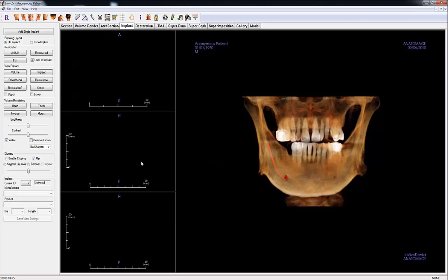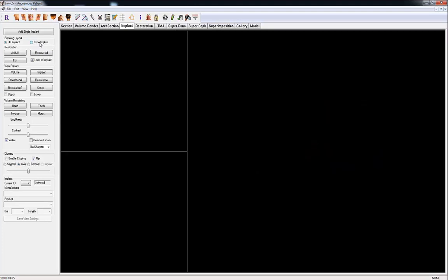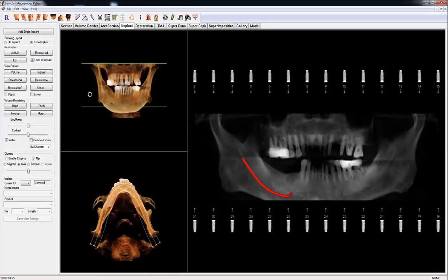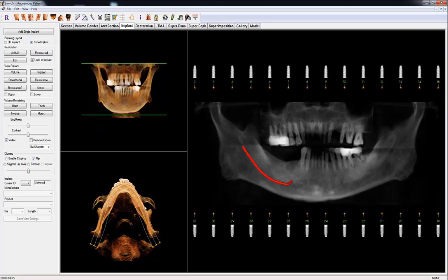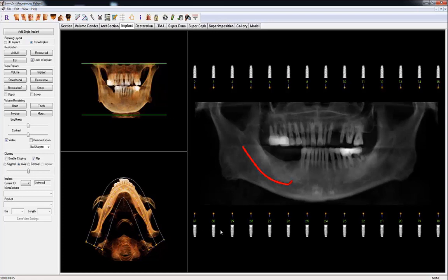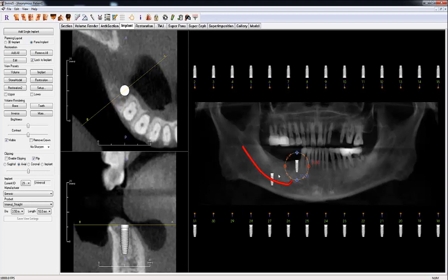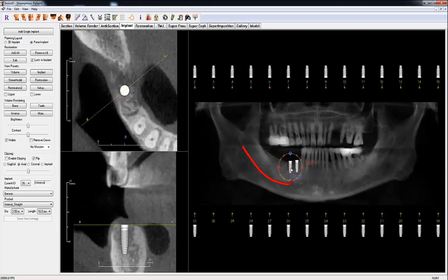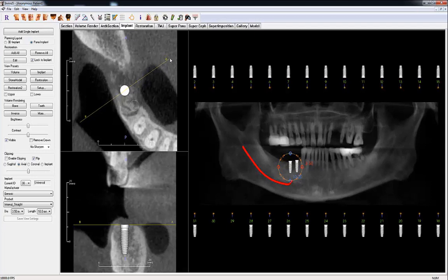The second method to insert implants is to place multiple implants in the panel implant view. To adjust the panel, you can move the upper and lower limits and arch spine to include preferred anatomy. To add implants, drag and drop the implants on the panel. Once an implant has been placed on the panel, the top window displays the axial cross-section. Remember to adjust the yellow AB line to be perpendicular to the arch to generate the buccal-lingual cut.